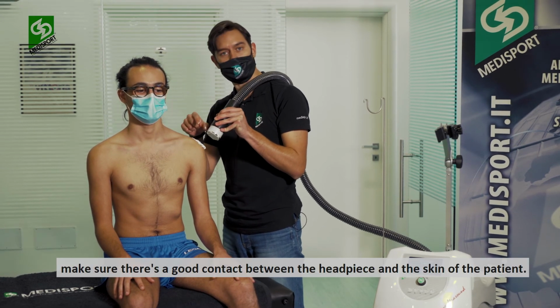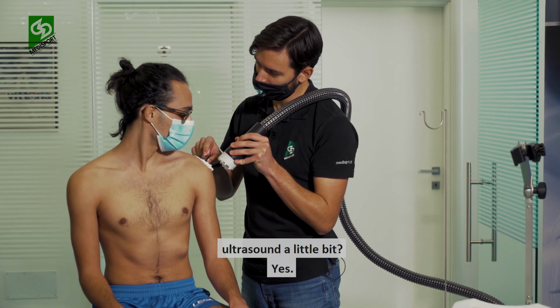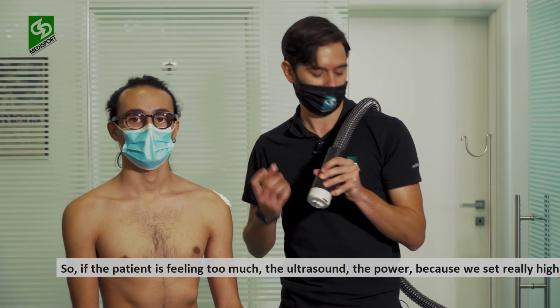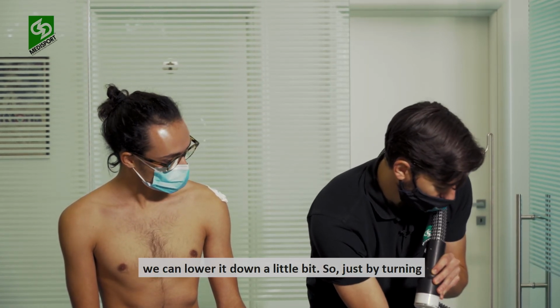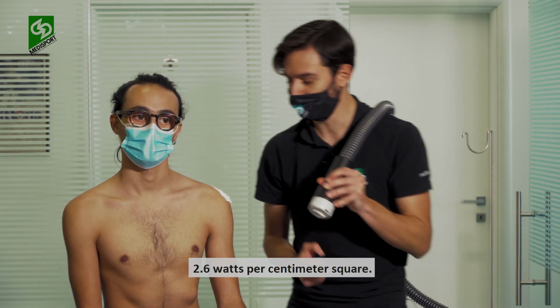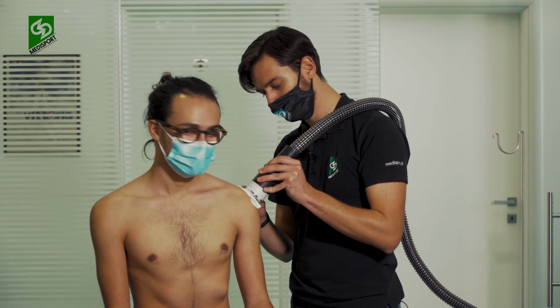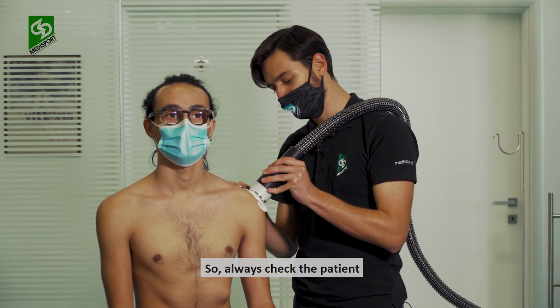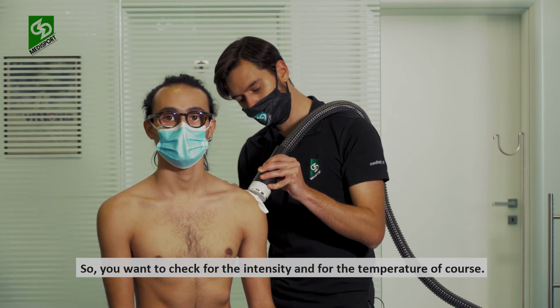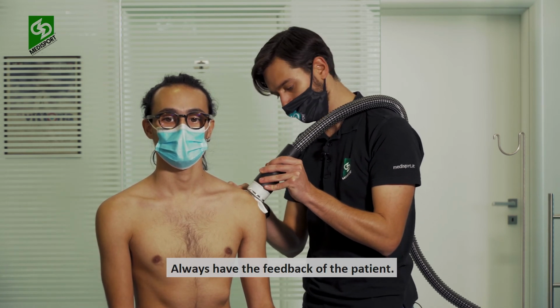Make sure there's a good contact between the headpiece and the skin of the patient. Do you feel the ultrasound a little bit? Yes. Too much? Okay. If the patient is feeling the ultrasound too much, the power, because we set really high, we can lower it down a little bit. Just by turning, we can go to 2.5, 2.6 watts per centimeter square. Is it okay now? Yes. Okay. So always check the patient, both for the ultrasound and the cryotherapy. You want to check for the intensity and for the temperature, of course. Always have the feedback of the patient.